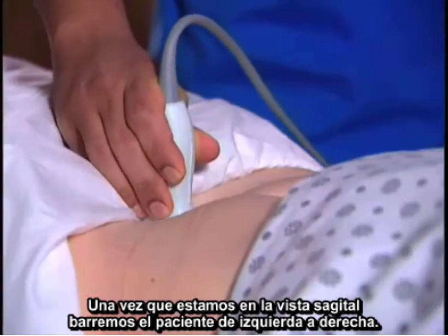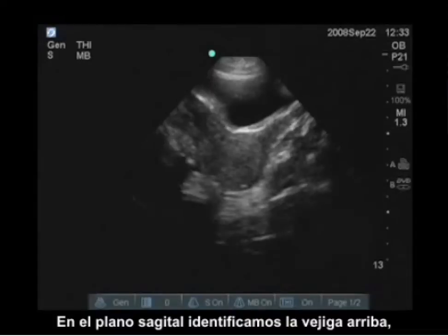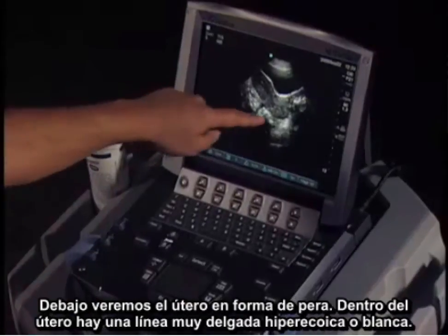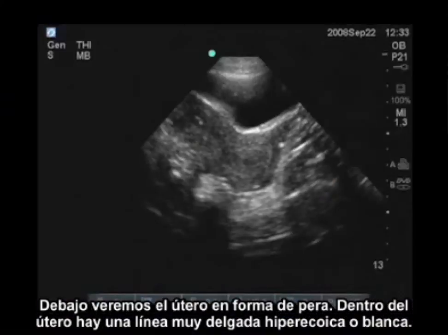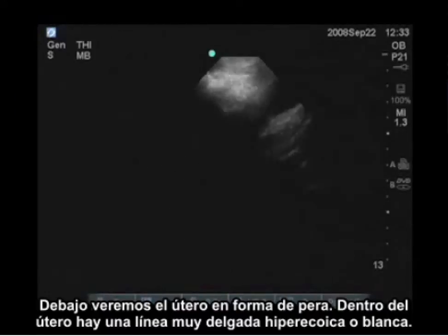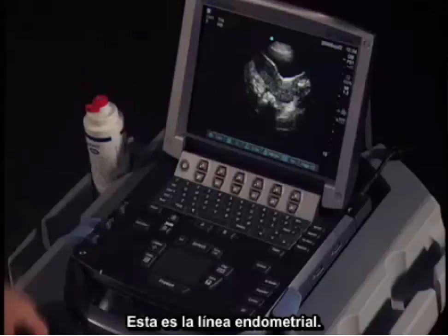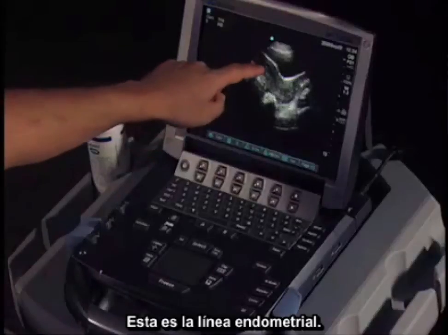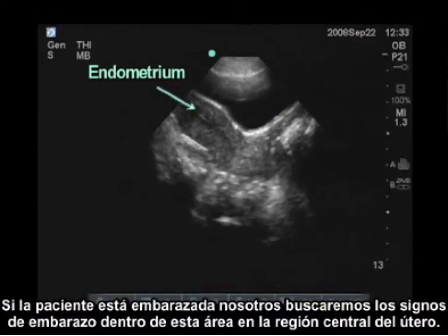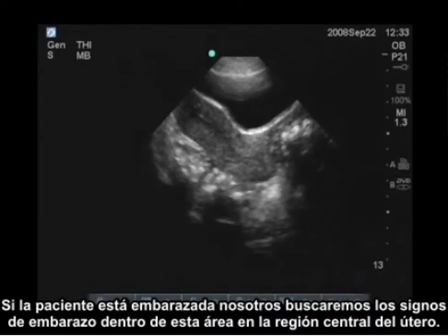When you're scanning in the sagittal plane, you identify the bladder at the top. Below that, we see the pear-shaped uterus. And within the uterus, we see a very thin line which is hyperechoic, or white. This is the endometrial stripe. If the patient was pregnant, we would be looking for signs of pregnancy within this area, within the mid-uterus.